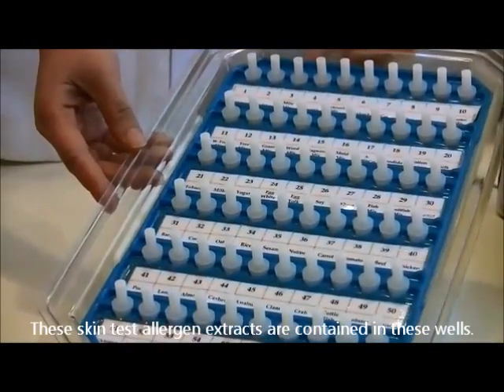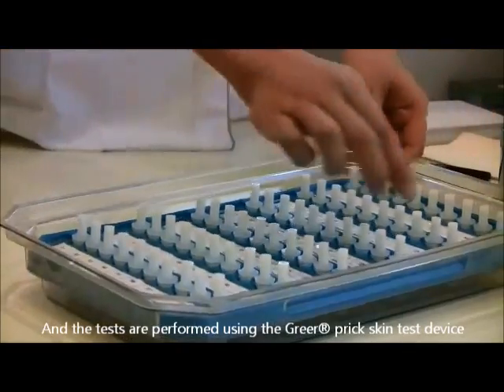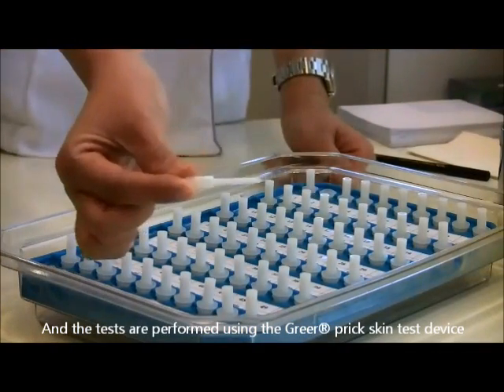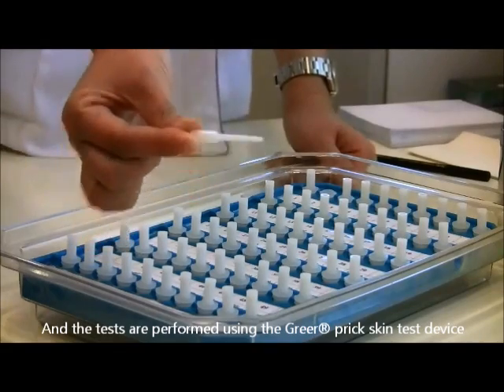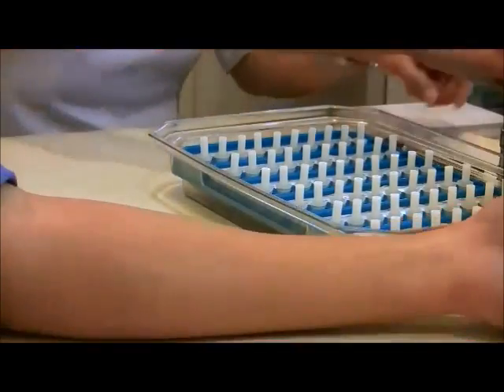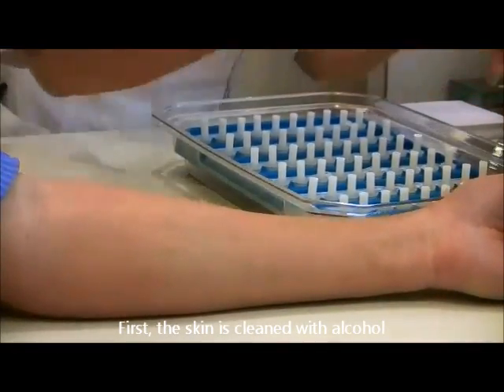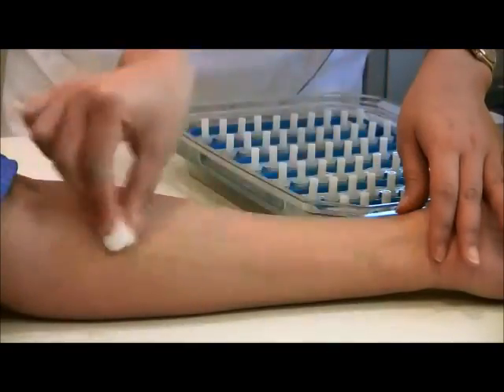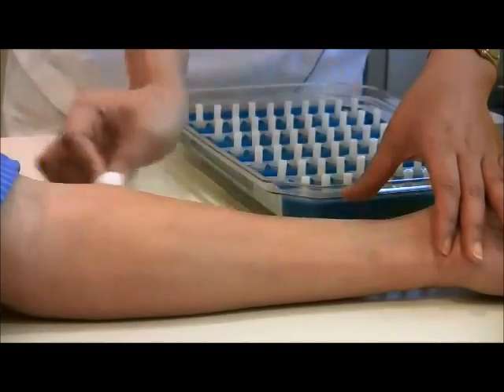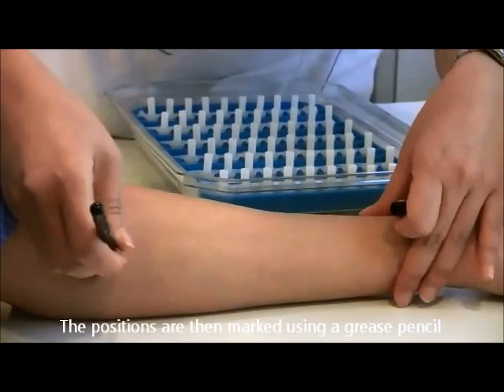The skin test allergen extracts are contained in these wells, and the tests are performed using the Greer Pick skin test device. First, the skin is cleaned with alcohol. The positions are then marked using a grease pencil.